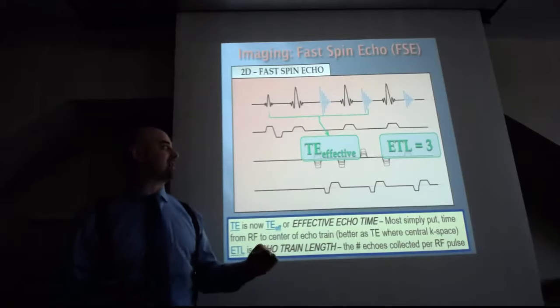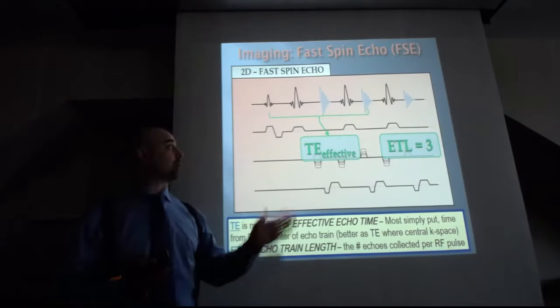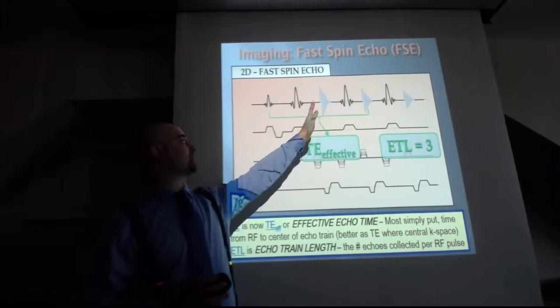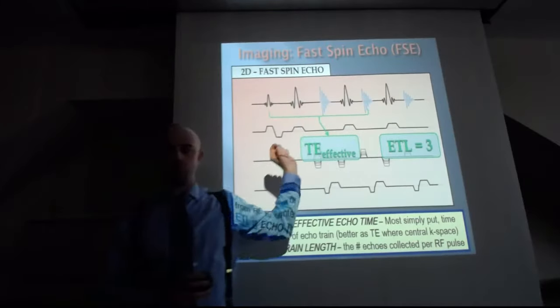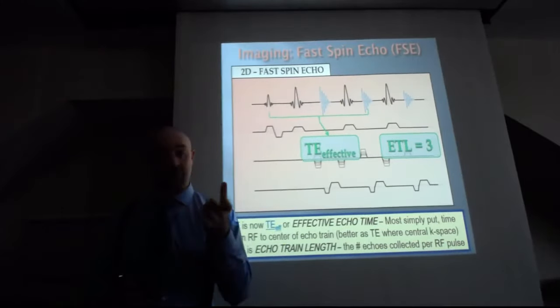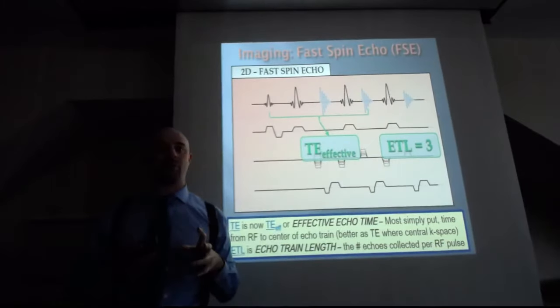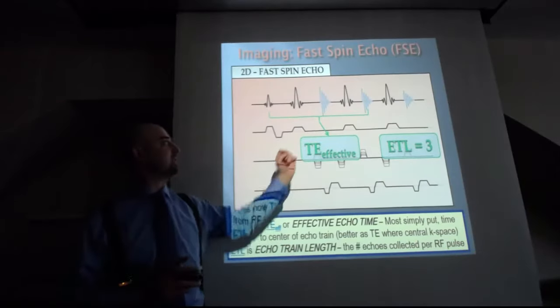This is a little bit more advanced, but you can specifically order the way you enter data into k-space. We'll see this in a little bit. Your first echo is the biggest, right? Even though you're dephasing and rephasing with the inversion pulse, you're getting echoes on the order of T2 decay instead of T2 star decay. I hope you're following me.